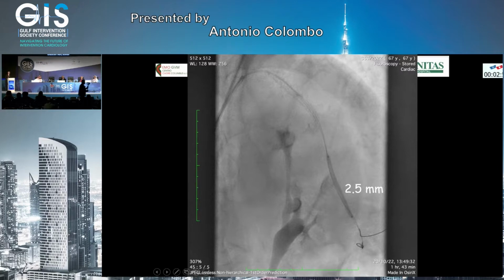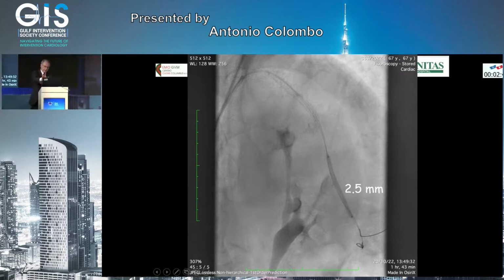This was done quite a while ago, maybe more than 1 year ago. We had not very reliable pressure wires; every time you connect and disconnect the pressure wire, you may lose the calibration. So at that time we utilized 2 wires.